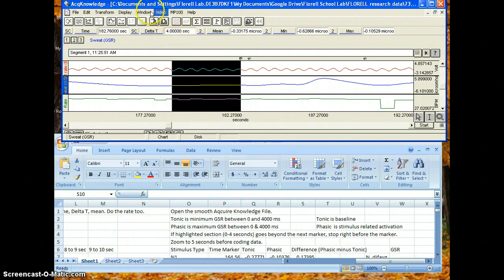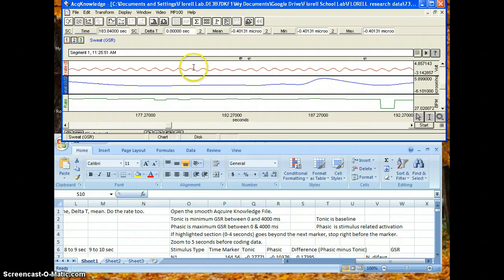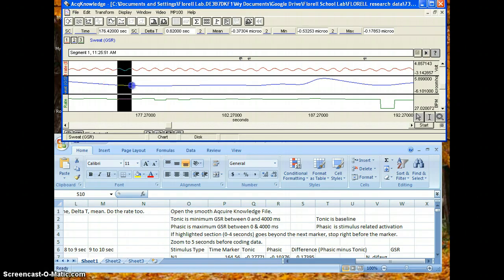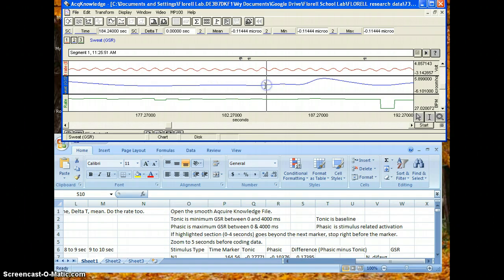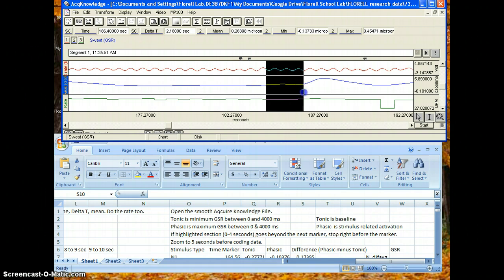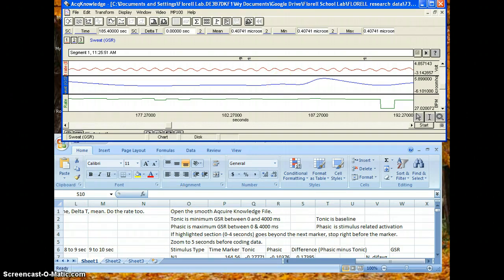And you see your time once again with your delta T. And if for some reason, which is likely going to happen, you're analyzing GSR that's flat but then peaks, then you only analyze to the peak. So let's pretend this is flat. If this was flat, you would analyze it to right here where it starts to go up. So that's how you do GSR.